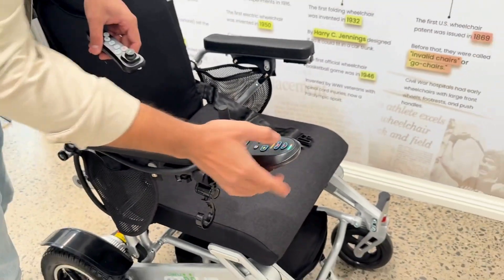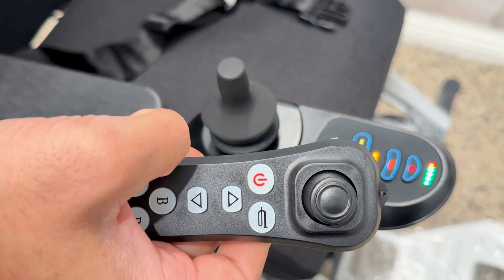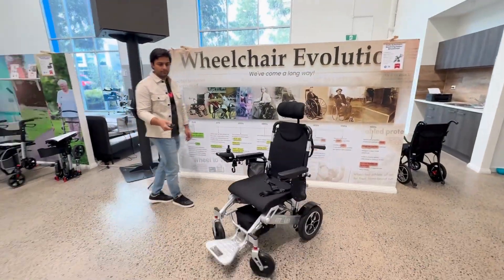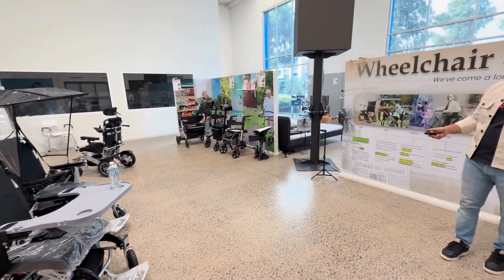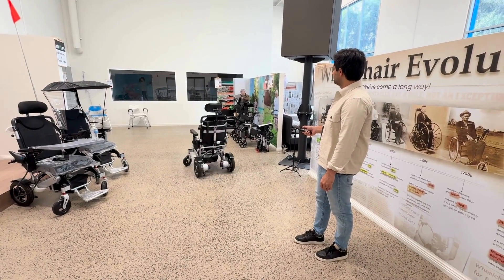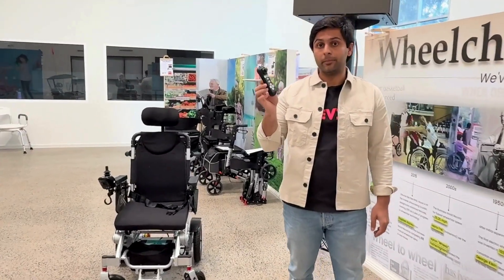The best feature of this wheelchair is it comes with the wireless skater remote. Simply you need to pair this with the wheelchair. First, you turn on the wheelchair. Then press this button for a couple of seconds. Once it starts blinking green, it means it is paired. Now you can operate this wheelchair. The connectivity range of this controller is 30 meters, which I will show you right now.